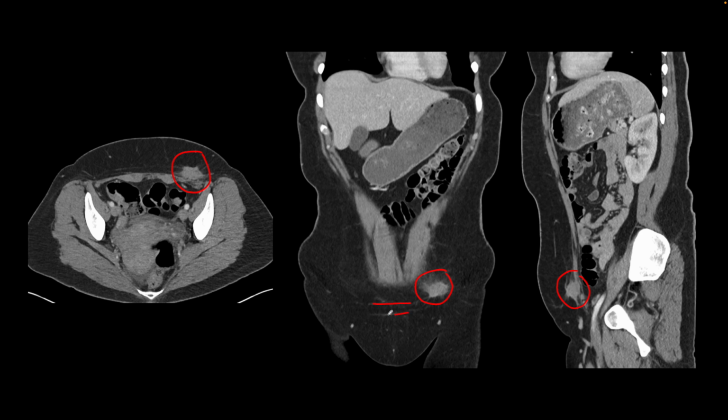We see some scarring here. This is the horizontal incision. They make the Pfannenstiel incision for C-section. So some endometrial tissue at the time of the C-section surgery got deposited inadvertently in the abdominal wall, and now she has symptoms from scar endometriosis.